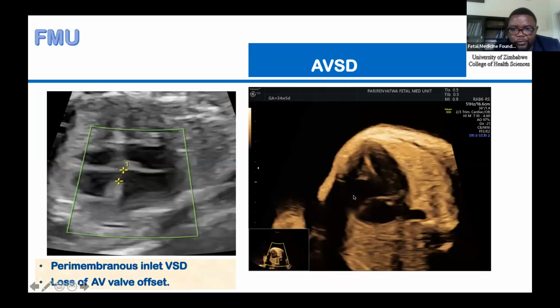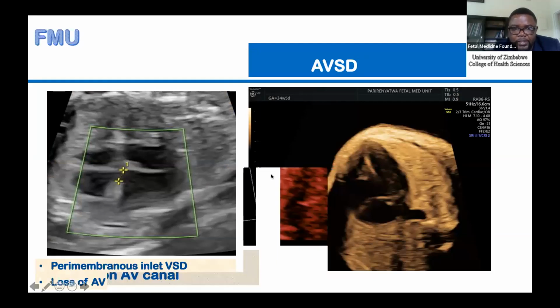Can I show you one image of AVSD? Where is it?